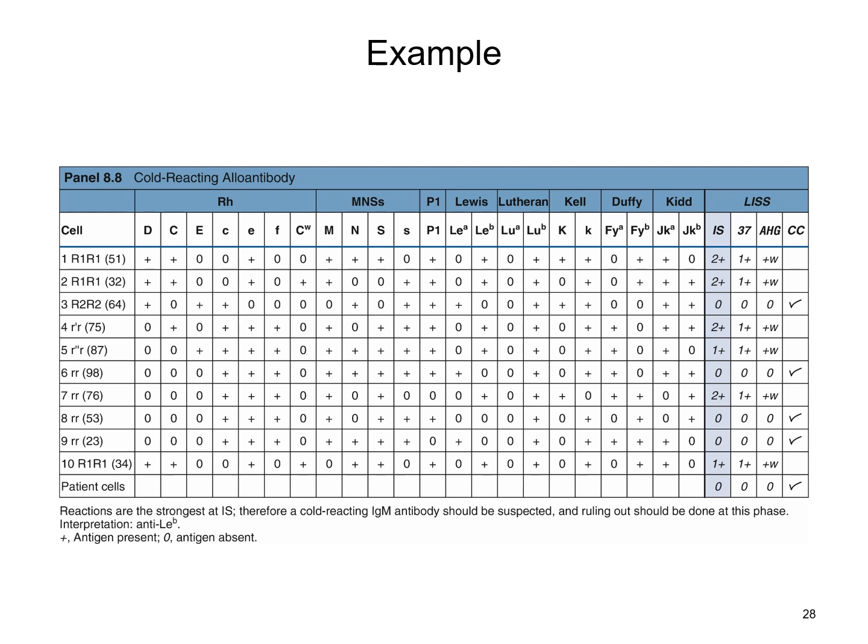Typically when you heat up your tubes, if there's an IgM type of antibody present, it's going to cause that antibody to not agglutinate as well, so it's actually going to get rid of them. But in this case, the antibody is so strong that you're still seeing it bridge over into that AHG phase. If I had a patient that demonstrated this, I would honor that cold reactive antibody the best I can, although sometimes it's a little hard.